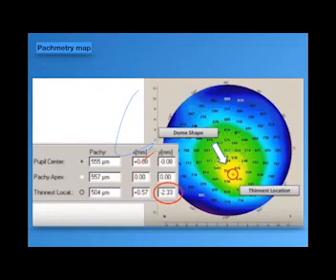So please study both eyes and correlate the four figures with each other, and you can consider this patient suspicious if you found that the difference between the pachymetry maps, for example, is more than 15 micron in both eyes. Okay.